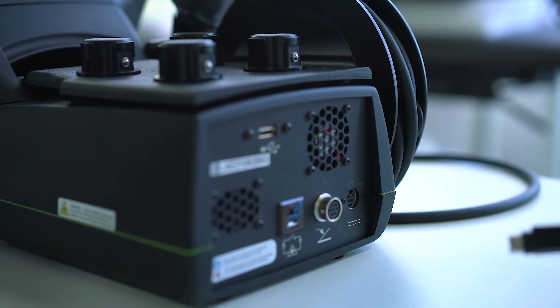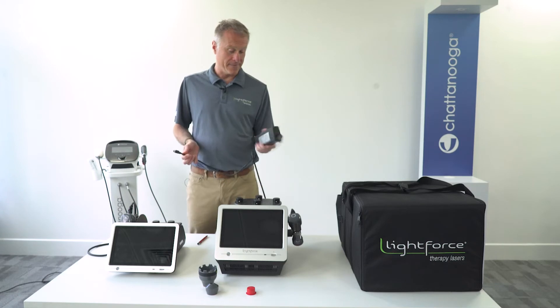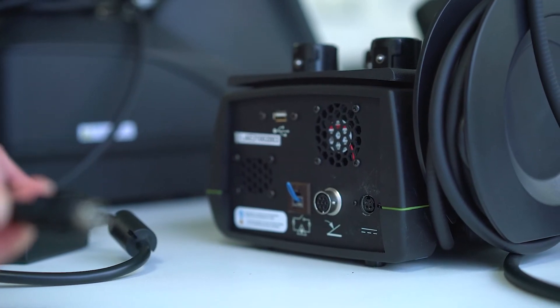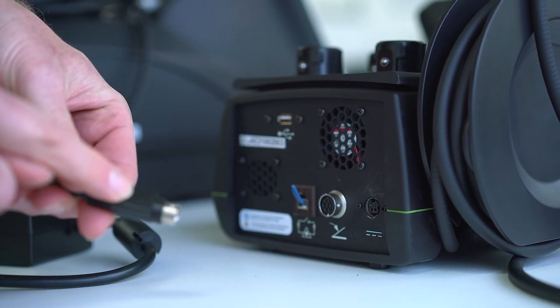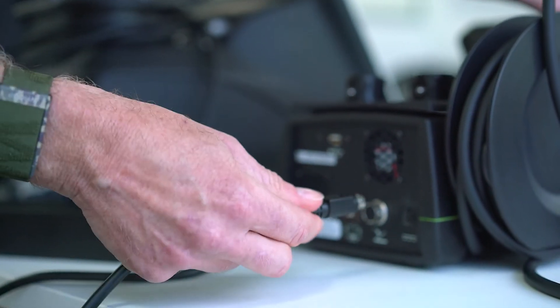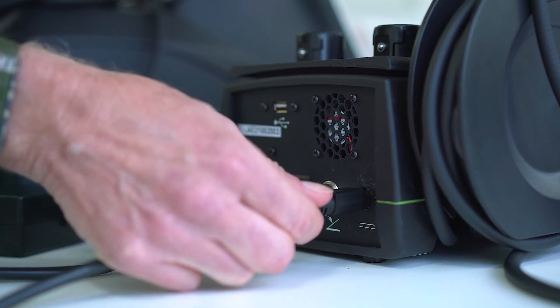For the FXI model, in order to keep the compact design, there's an external AC charger. When inserting the power cable, there's a flat side with an arrow on top — make sure that that's facing upwards when inserting into the port on the far right side at the back of the laser.